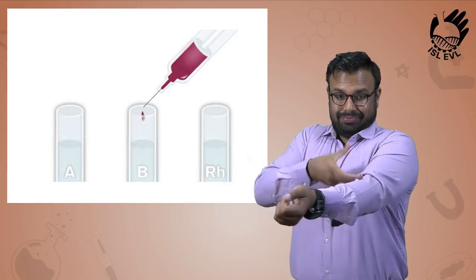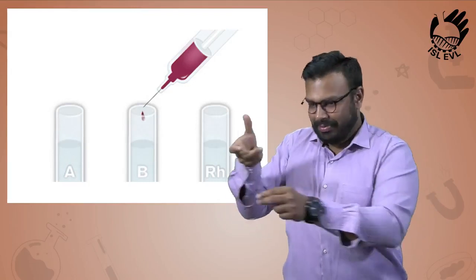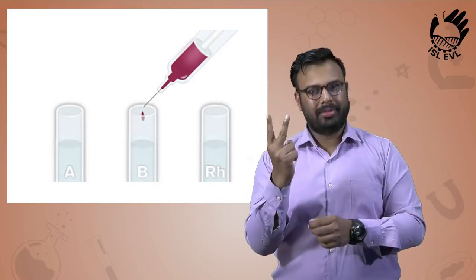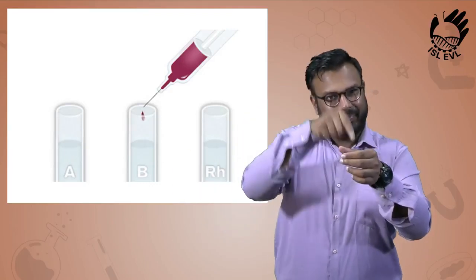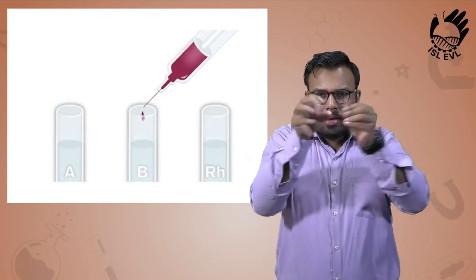Your blood cells are mixed with antibodies against type A and type B blood. The samples are checked to see whether the blood cells are sticking together or not.